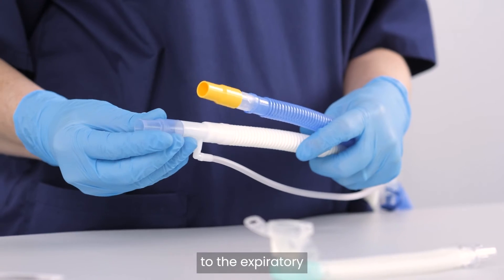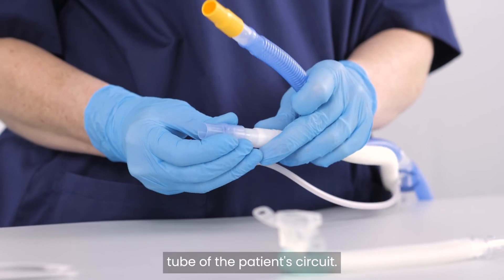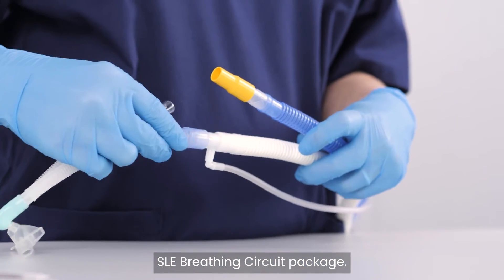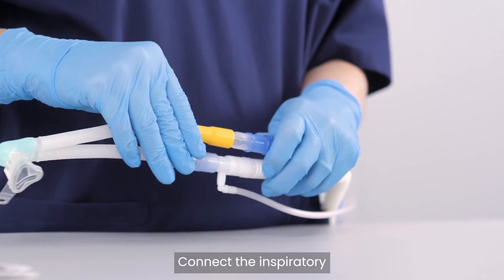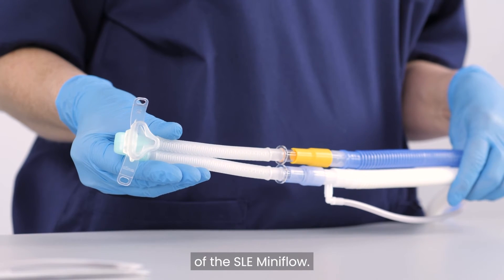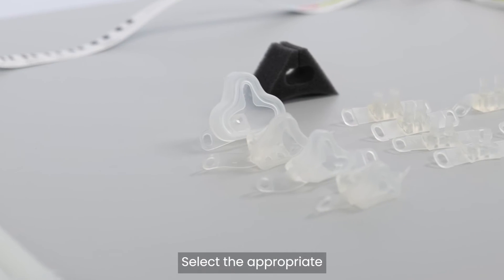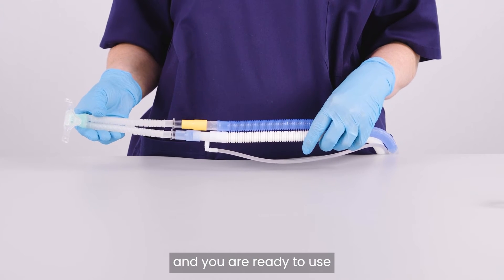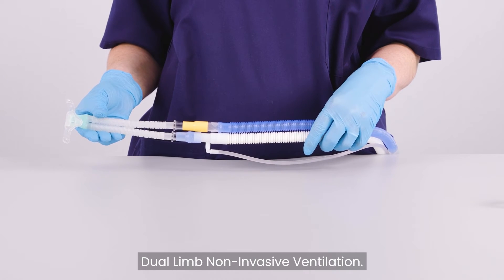Connect the blue connector to the expiratory tube of the patient circuit — this can be found in the SLE breathing circuit package. Connect the inspiratory and expiratory limbs to the connections of the SLE mini-flow. Select the appropriate mini-flow accessories for your patient and you are ready to use dual-limb non-invasive ventilation.